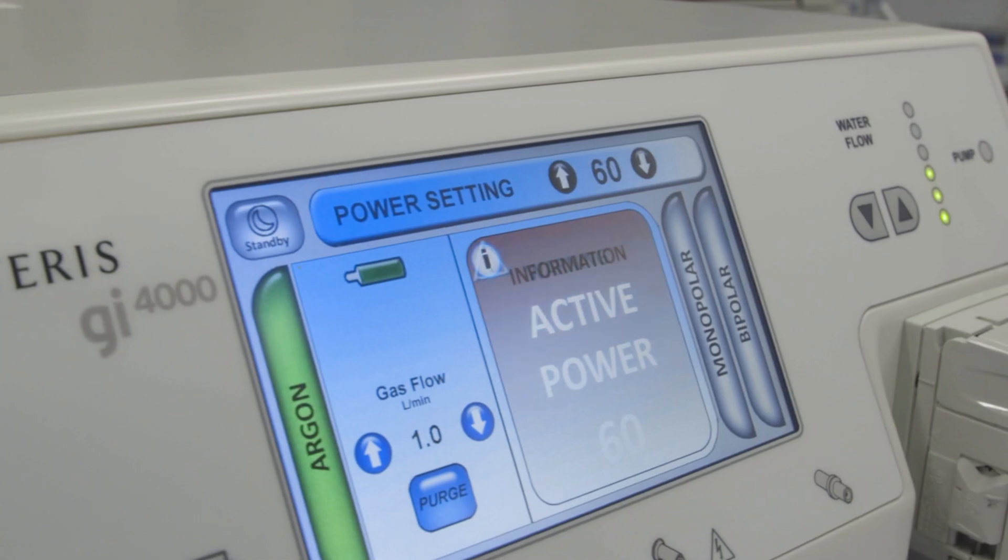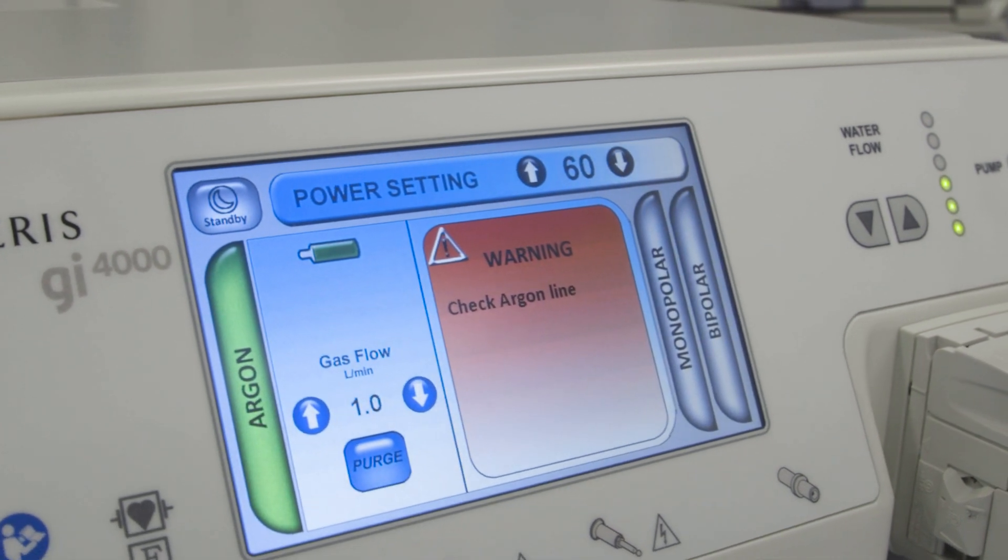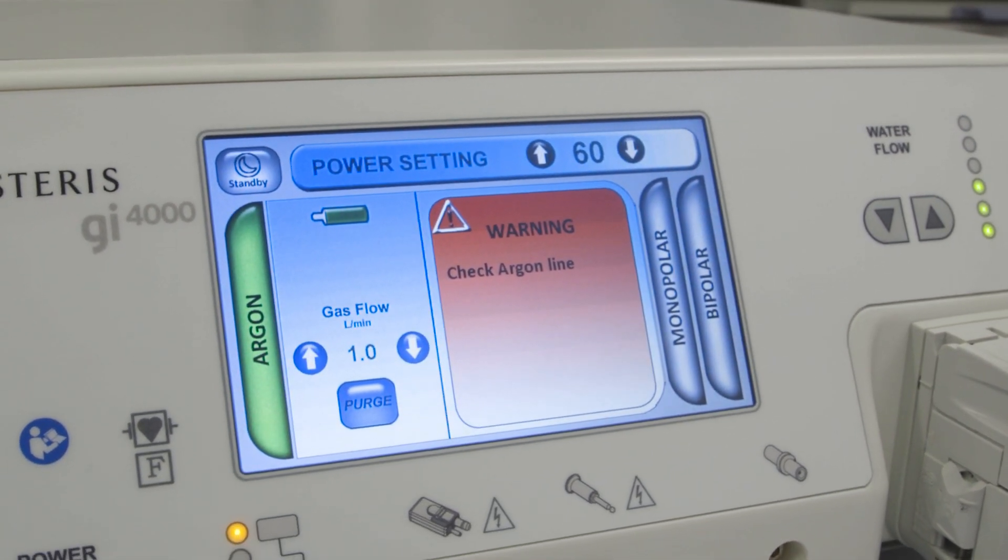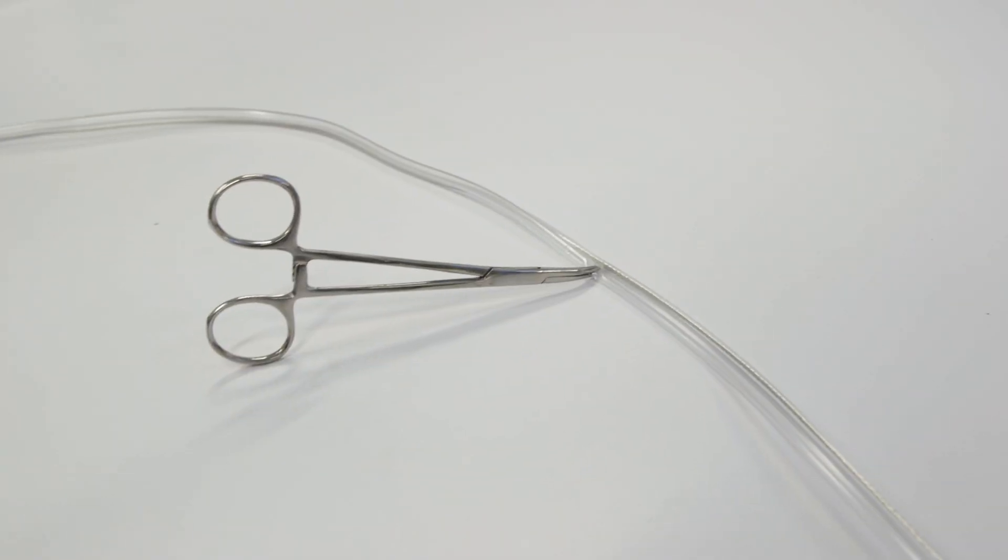Warning, check argon line. The check argon line warning can appear if the argon gas delivery line is occluded, pinched, or clogged.